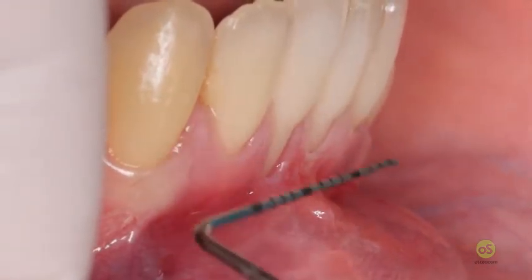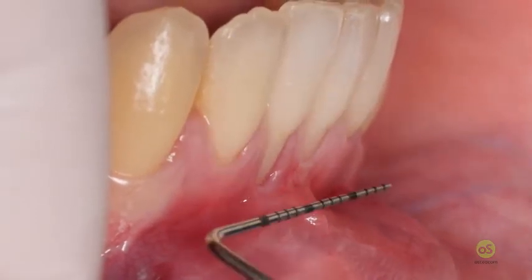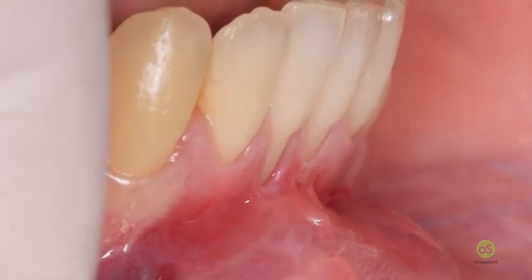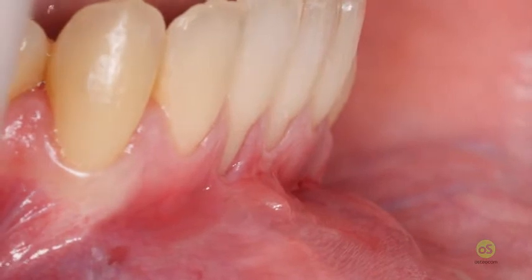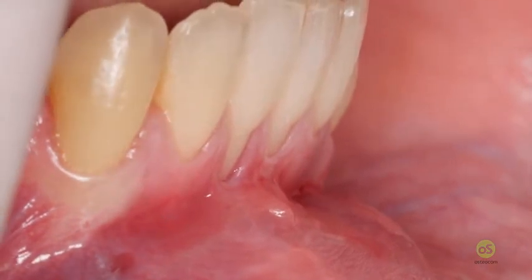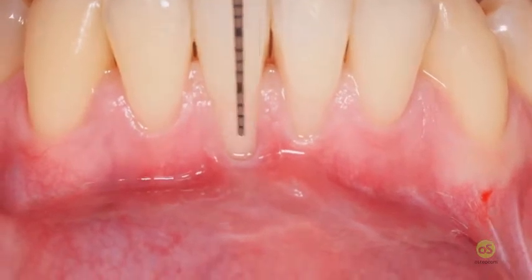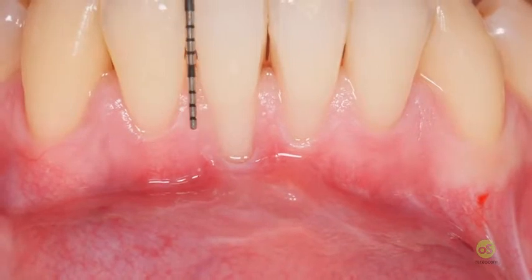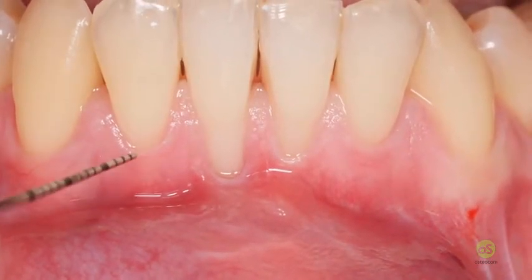If we advance the flap, here we place the muscles coronally, so we have to create a flap that will be verticalized, and this is something that we will see a bit better, I hope at least, at the end of the surgery. We don't have to do the same thing we did in the upper jaw, that is recession plus one, starting from the tip, because this makes the incision very, very apical.